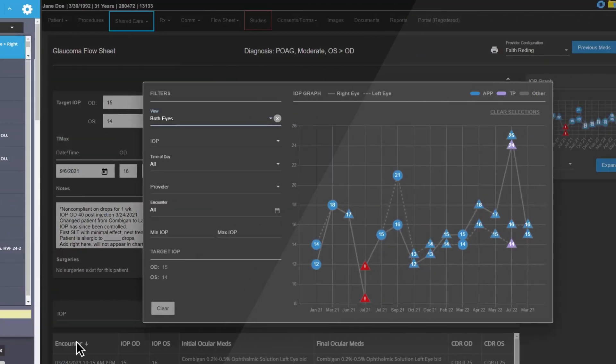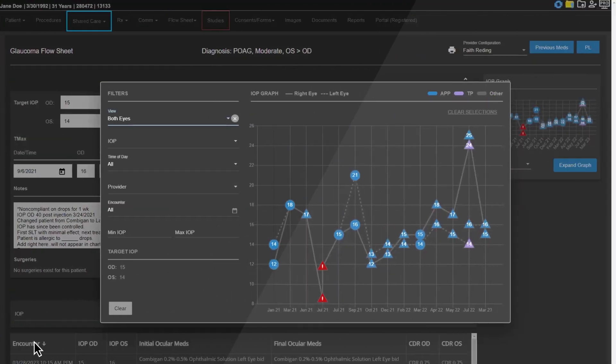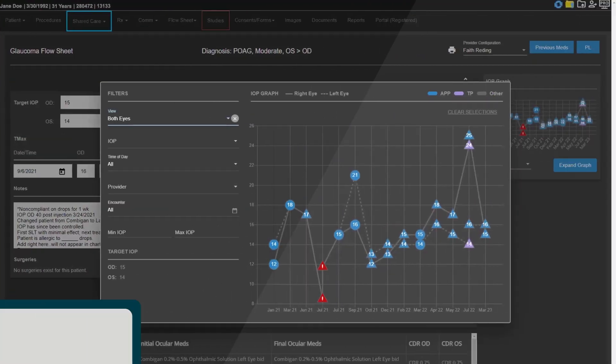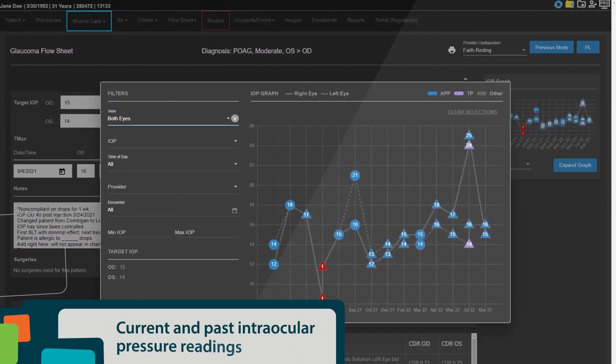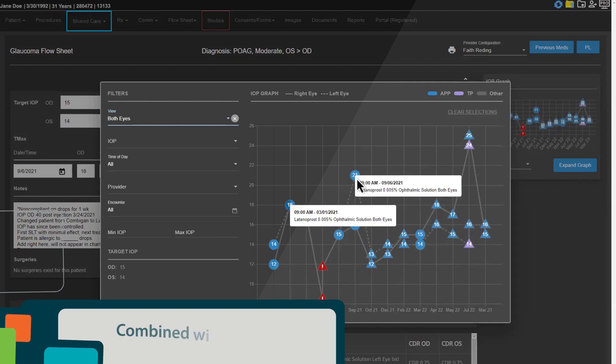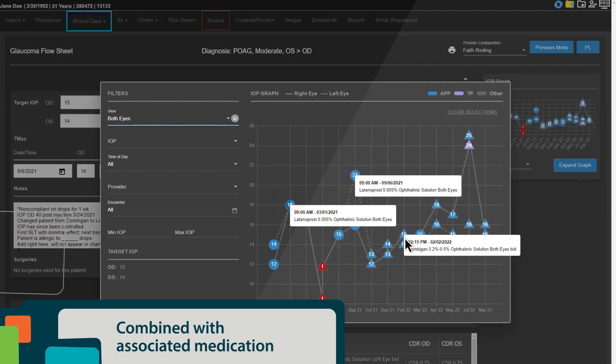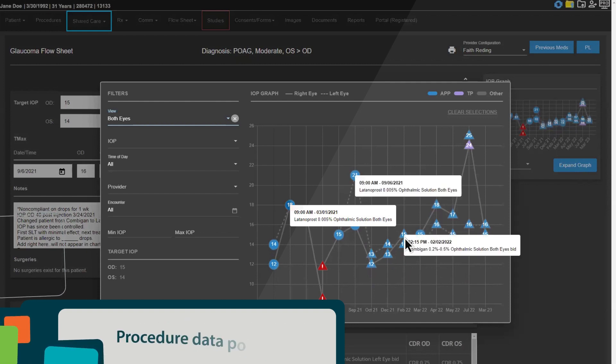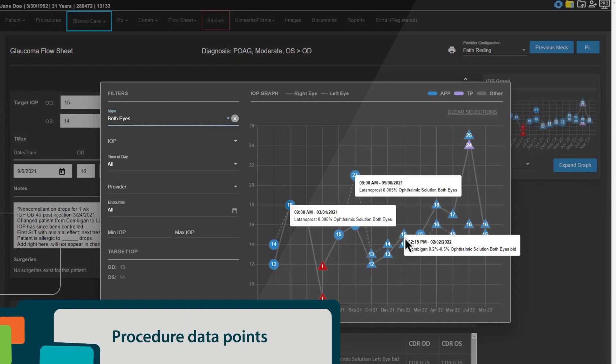Easily monitor patient trends over time, including current and past intraocular pressure readings combined with associated medication and procedure data points.